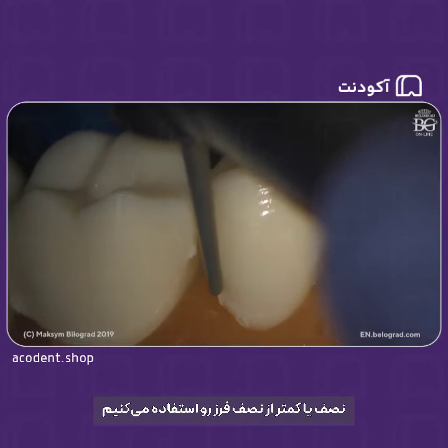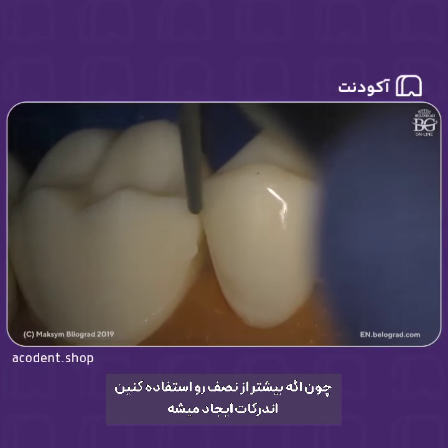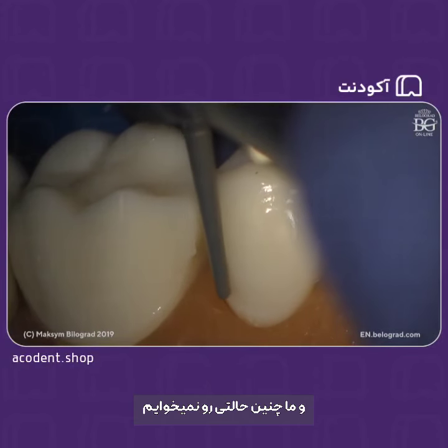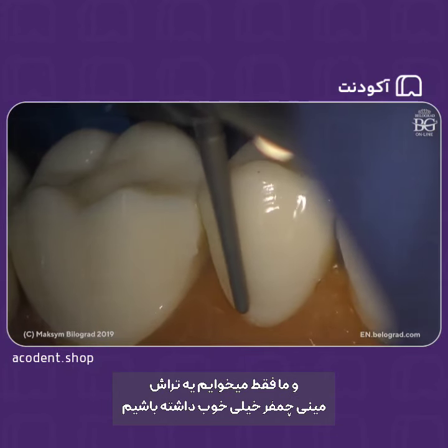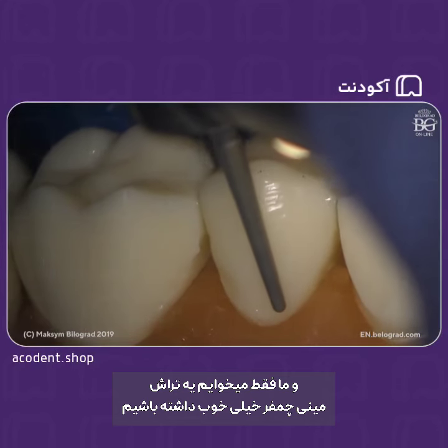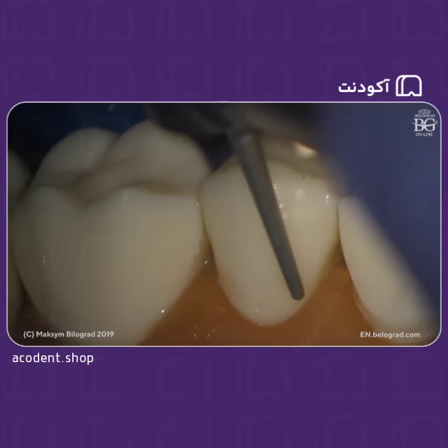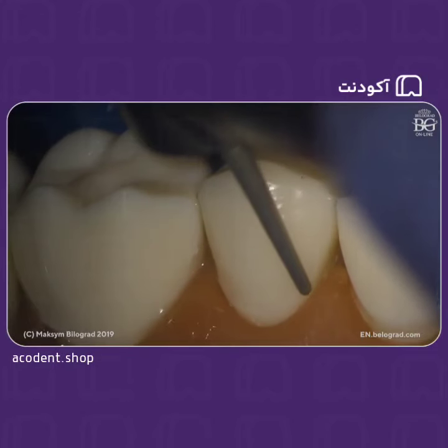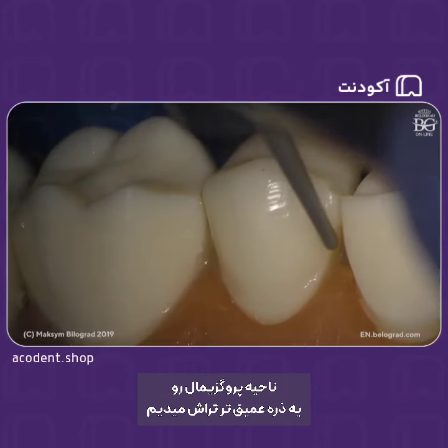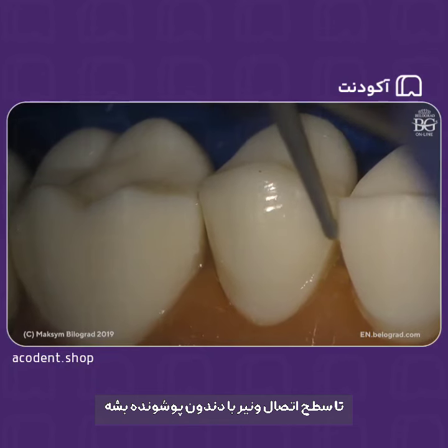Half of the burr or less. This is important, because if you use more than half of the tip, you would make an undercut, and we don't want to make undercut. We will just need to make a really good mini chamfer preparation. From mesial also, just go a little bit deeper to the mesial proximal zone to mask the transition here.